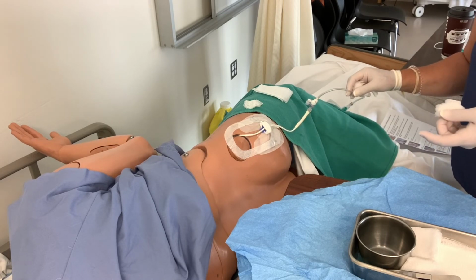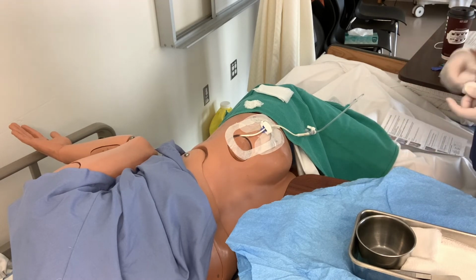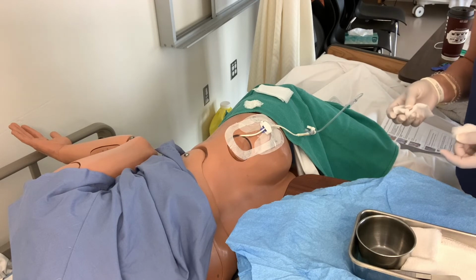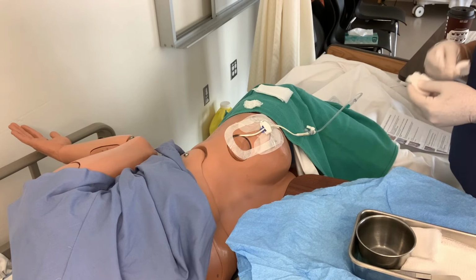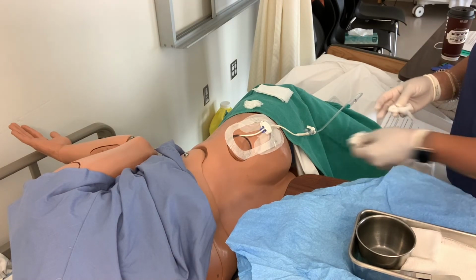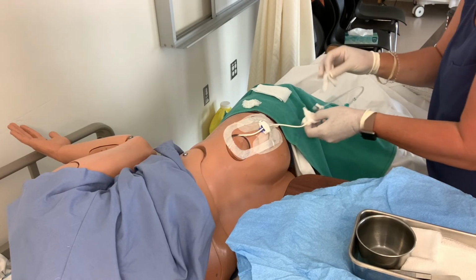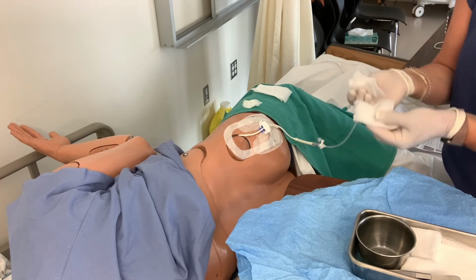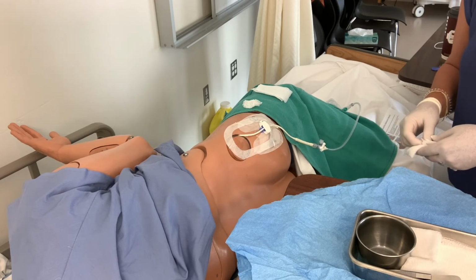Where students tend to get all mixed up is they don't know what to touch and what not to touch. And my way of encouraging students is just do it all, but don't ever touch the tube. Always try to hold it with sterile gauze. You're going to see a lot of variations in practice in this. So just have your sterile tray, and just pick up the gauze. It's super easy. Anytime you touch the stopcock or anything, you're doing it with sterile gauze. And that's the flush portion of a percutaneous drain.